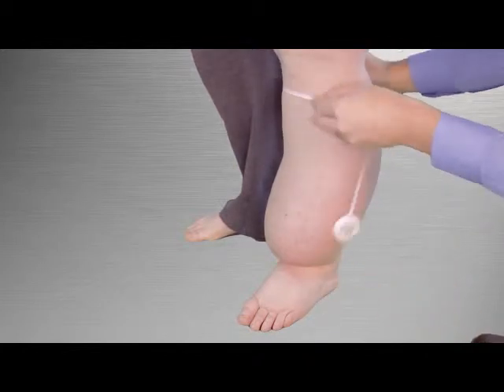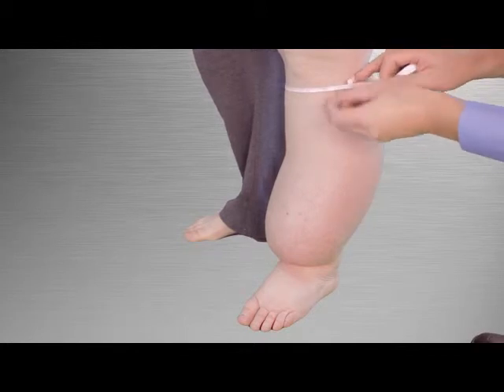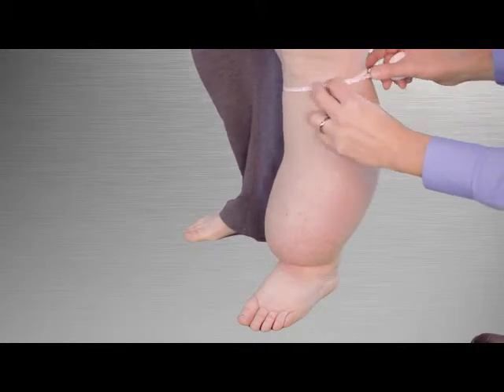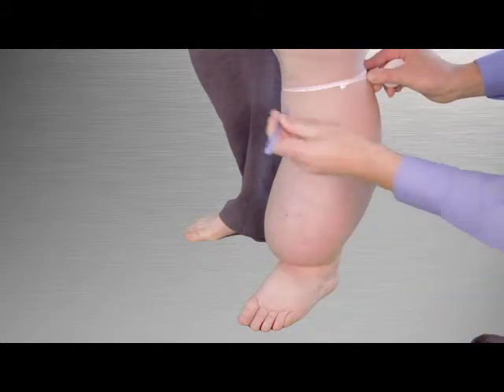First, wrap the measuring tape around the leg with the top edge positioned where the top of the garment will end. Do not pull the tape tight — just apply light tension to hold it against the skin.